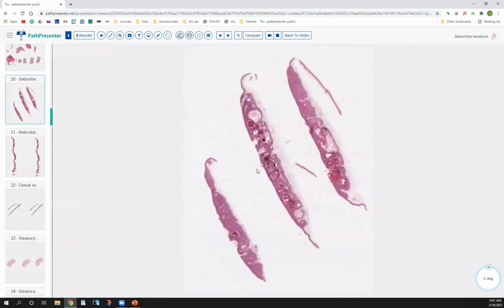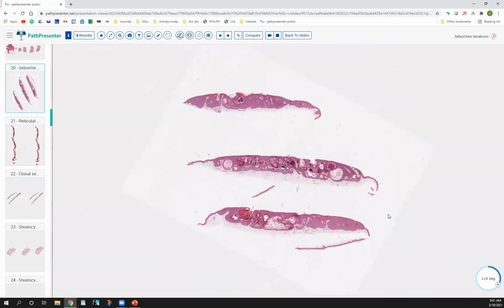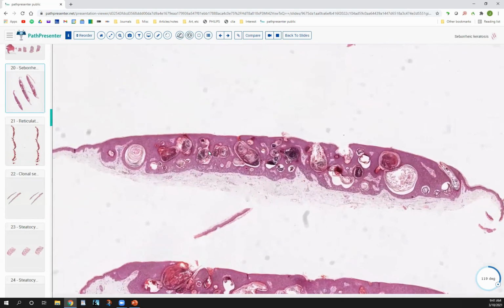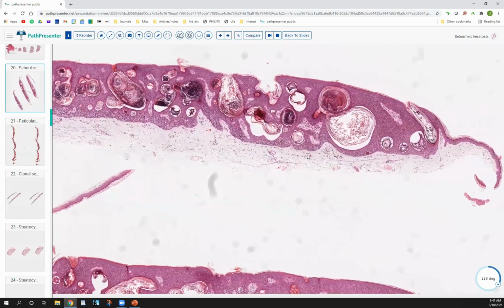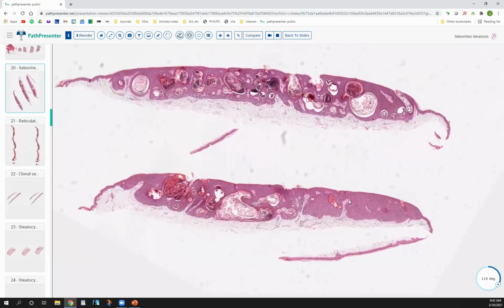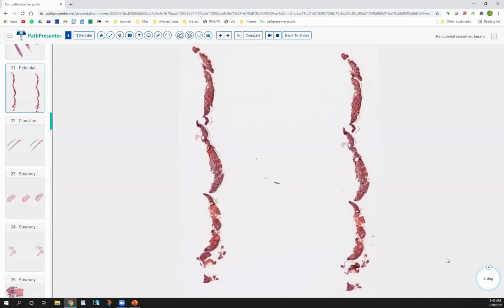Okay, switching gears now, here's another very common thing that we've already talked about, very easy to recognize with that stuck-on appearance, that epidermal thickening, and tons of horn cysts. This is our very common lesion, which we know and love, our seborrheic keratosis. I'm going to cover just a few of the variants because we'll see a lot of these. So this is the more conventional one. And changing to this slide, we'll go into a little bit of a different kind.